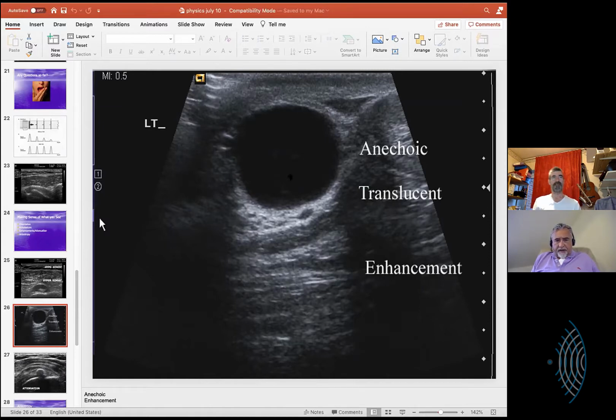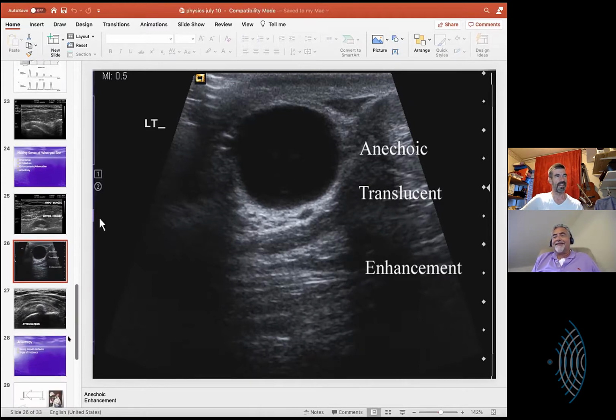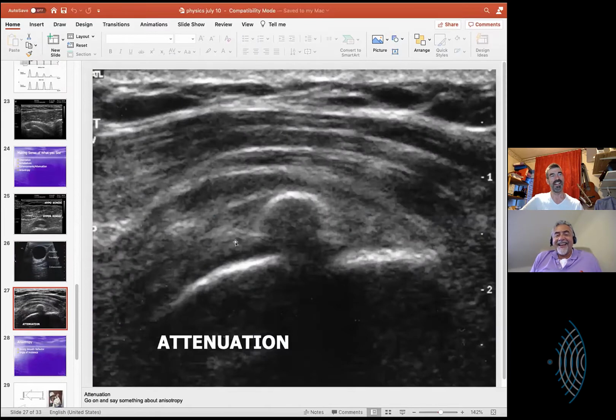I was thinking that's not a testicle there. That's a cyst near a testicle, like a varicocele or something like that. Well, it's called an epididymal cyst. But yes, a varicocele would probably be somewhere down here. But yes, you have too many brains for as short a hair as you've got. And this here is. Oh, don't go any faster.